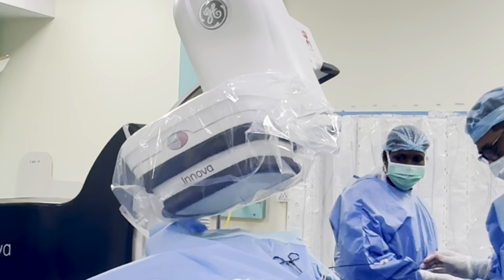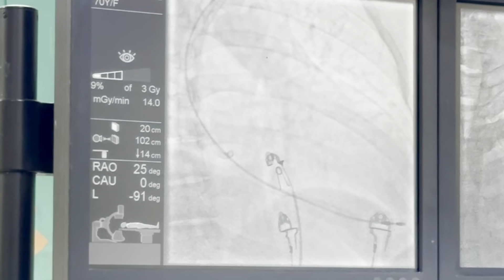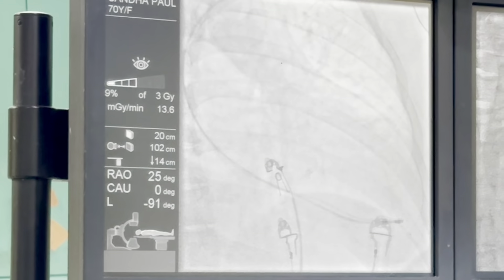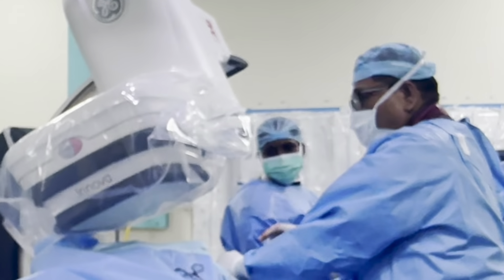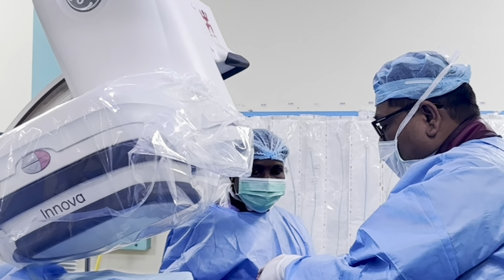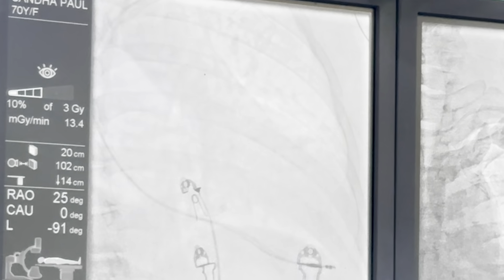You should try to get into it. Less RAO, less RAO. Now you can see the logo. This sheath I will be taking into the RV here. Here you require a torque — if you go anti-clockwise and clockwise. A clockwise turn will take this catheter posteriorly and you can face the tricuspid valve. I am going in here and rotating it a little toward the septum.